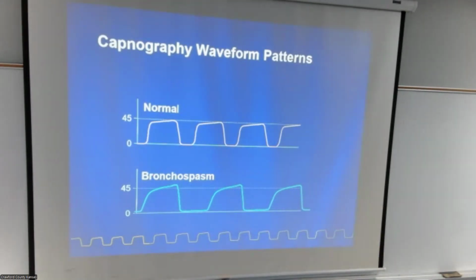So when you pick up your next patient that says, hey, I'm having an asthma attack, you can throw them on there. If you see shark fins, they're truly having some bronchospasms going on. Now, we do have a lot of people that have wheezes.